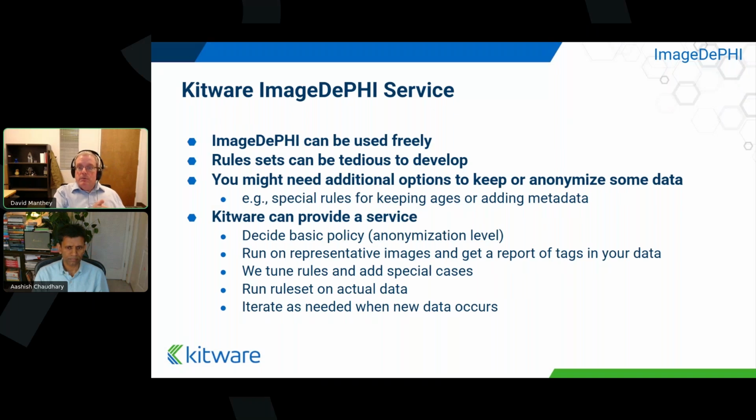We've done this for other projects where we've said, hey, we want to get data from a specific database using actual PHI, look up in the database, get tumor information, add it to images, have the tumor information in the image, but not the PHI in the image. And so these are the sorts of things that you can have as customizations and readily add into your system, so that way when you're doing your learning or machine processing or anything else, or even if you're just sharing it, that metadata is with it instead of having a sidecar file with all that information.